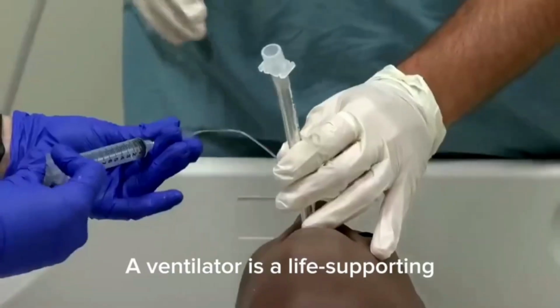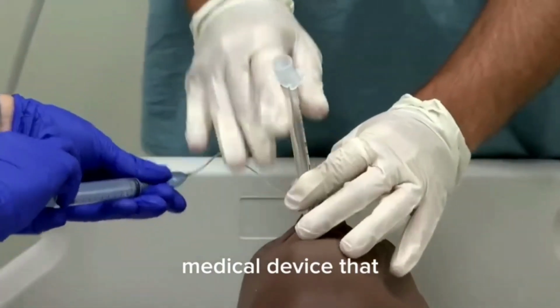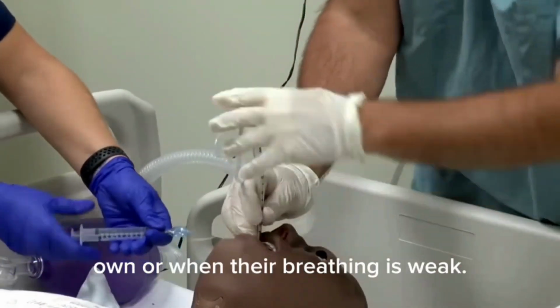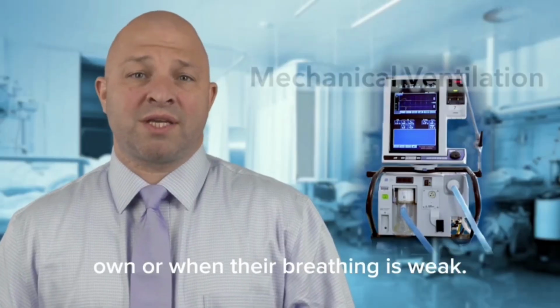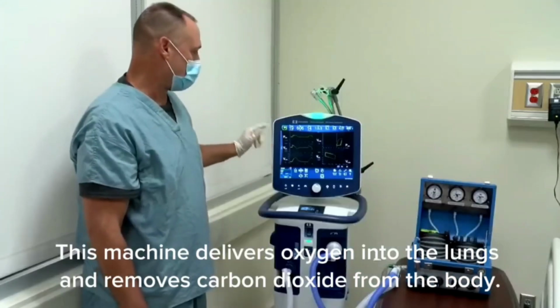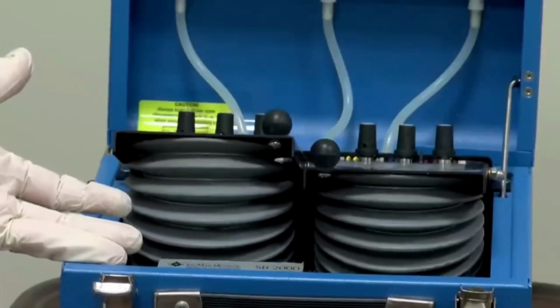A ventilator is a life-supporting medical device that helps patients breathe when they are unable to do so on their own or when their breathing is weak. This machine delivers oxygen into the lungs and removes carbon dioxide from the body.